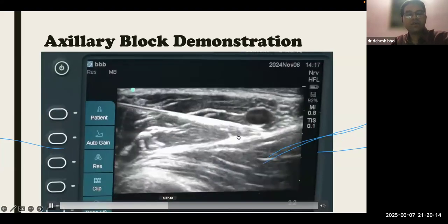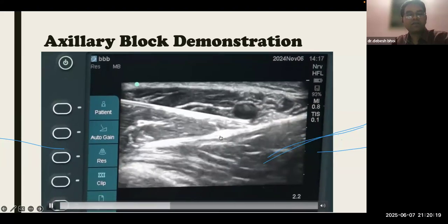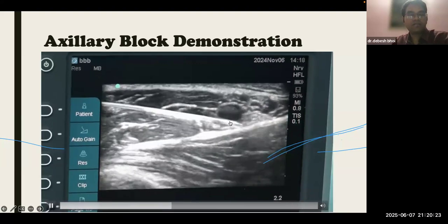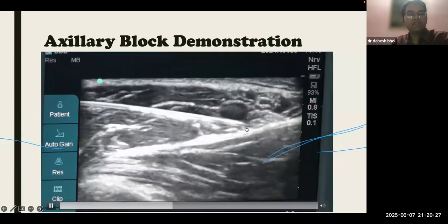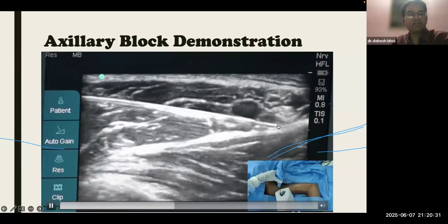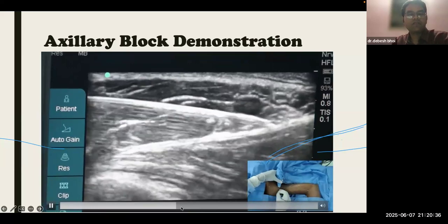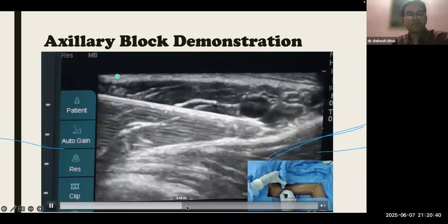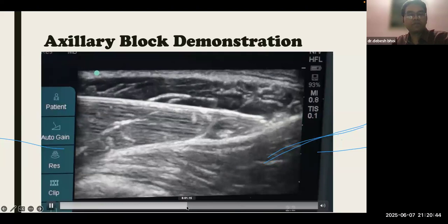In this case, I have gone posterior to the artery. This is the tendon that is posterior to the artery. So we try to hydrodissect posterior to the artery. Give saline. And this is the location of the radial nerve. So you can put some saline over here so that the nerve can be delineated, or just take the nerve out from here, and then subsequently you can put some saline. I can just lift the probe so that I can see the vessel.